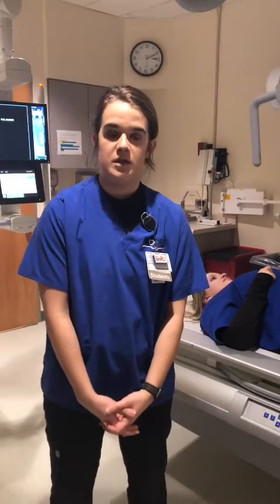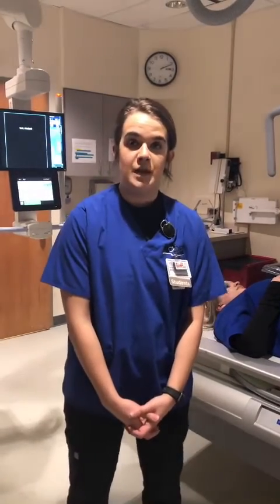Hi, my name is Madison, and the pathology that I picked was hydrocephalus. For hydrocephalus, you do a shunt series, which includes a PA skull and an AP supine abdomen. So right now, I'm going to demonstrate how to do the AP supine abdomen, also called a KUB.